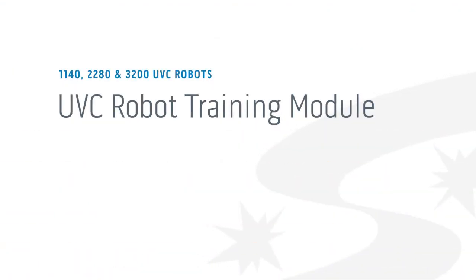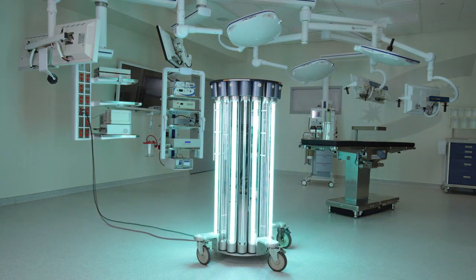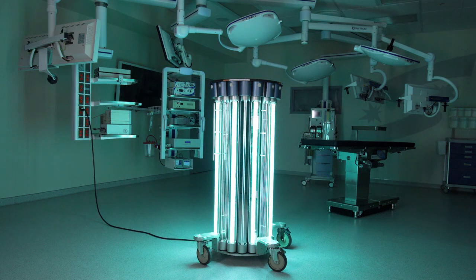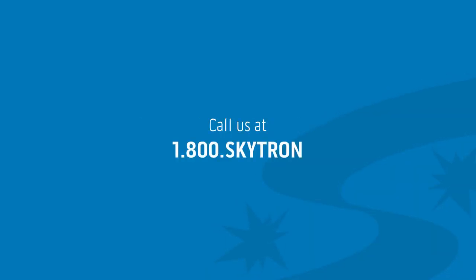If used properly, the Skytron UVC robot will safely disinfect the air and surfaces in any room in your facility while permanently tracking and storing digital documentation. For more information, visit us at Skytron.com or call us at 1-800-SKYTRON.